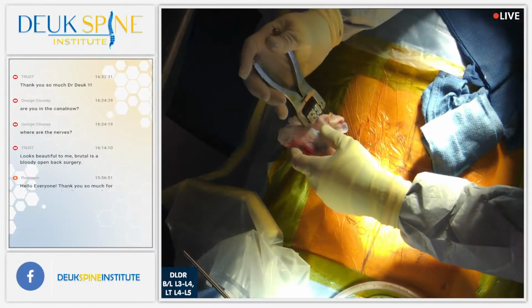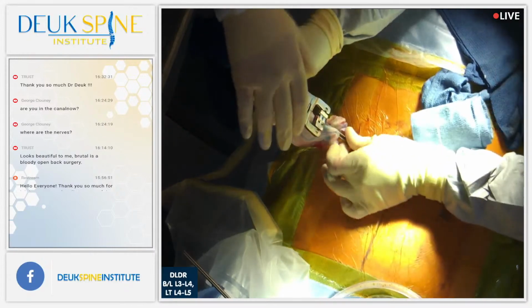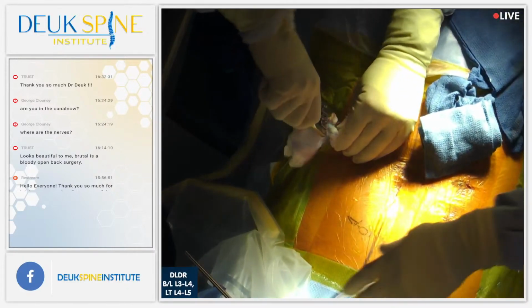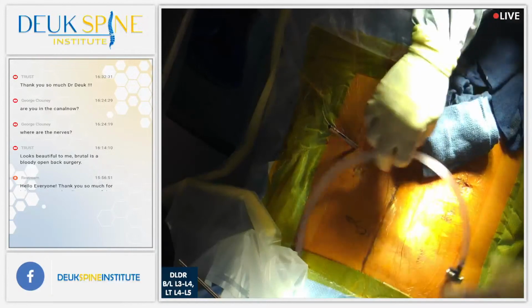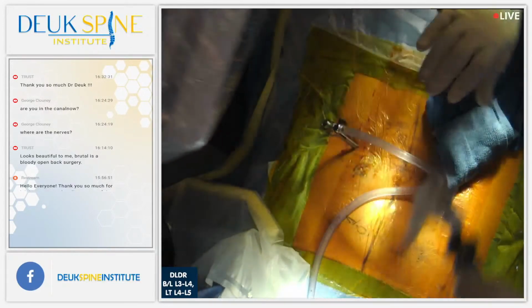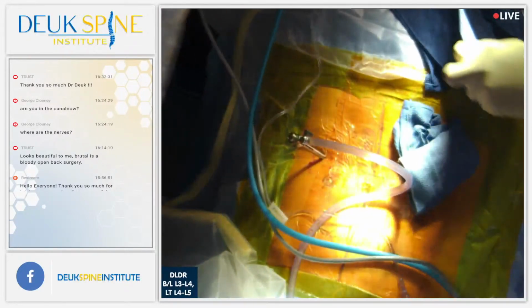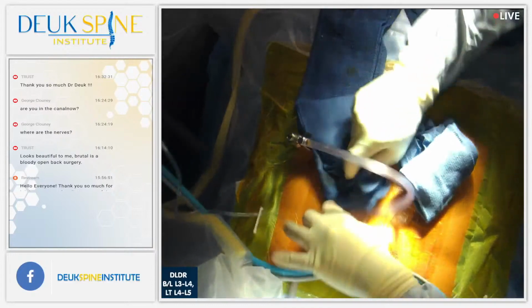Shot. Looks good. I'll do this. Go ahead. All right. Why don't you staple? Thank you. I got it.